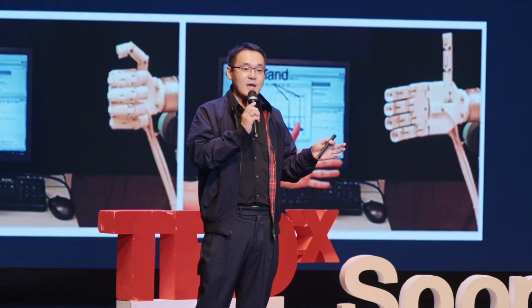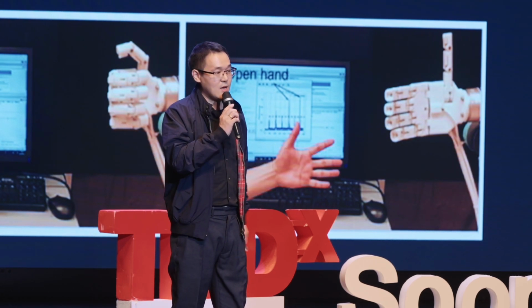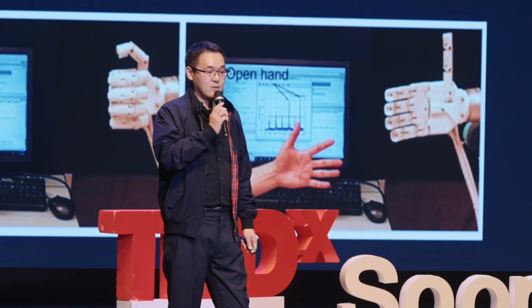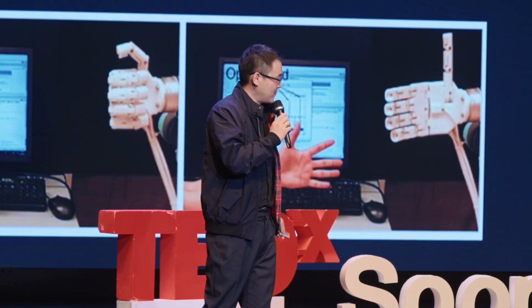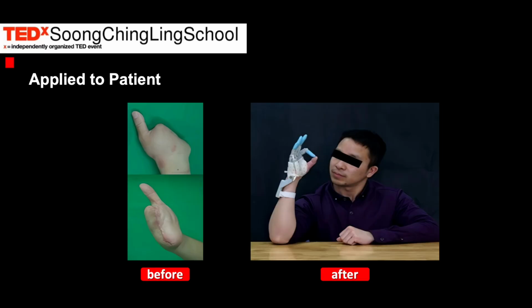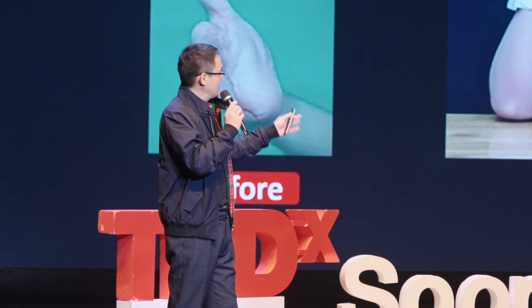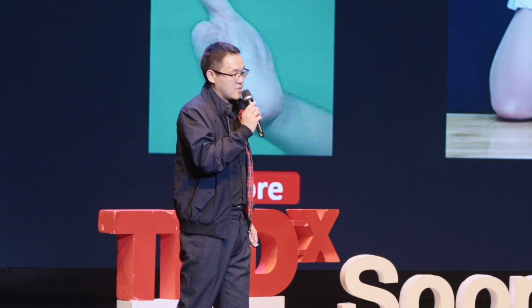If we can get the tiny movement from your muscles, we can use these signals to control our prosthetic robot. But this needs days and months of practice. We applied EMG signals to our patient, who had lost his 4 fingers and nearly half of his palm, and we gave him a totally new, intelligent prosthetic hand.